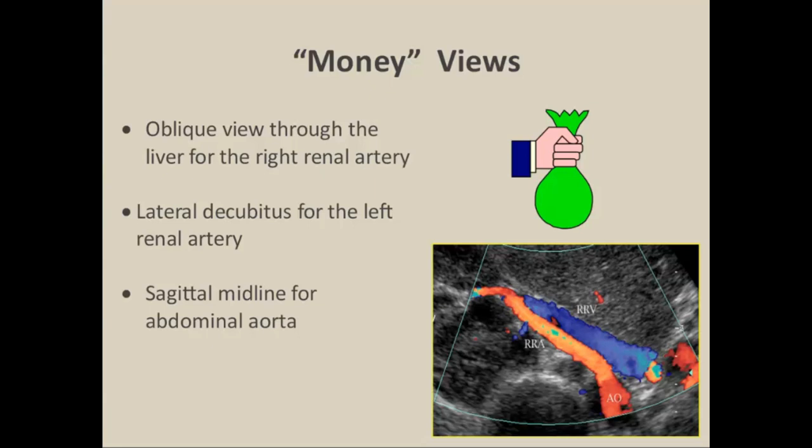One important trick is to observe the color pattern. If you've optimized the color flow pattern by adjusting the pulse repetition frequency to laminar flow, you'll also see signs of stenosis. For the left side, we put the patient left-side-up, scan through the left kidney, and identify the renal artery from that projection.